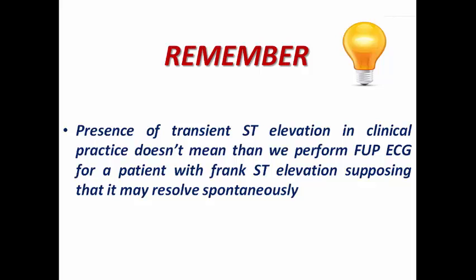So remember, presence of transient ST elevation in clinical practice doesn't mean that we perform follow-up ECG for a patient with frank ST elevation. I don't mean this, of course, because some people may suggest that in order to define STEMI, we should have persistent ST elevation in ECG, so you would have two serial ECGs. This is completely wrong, and just ST elevation in one ECG is enough to go for primary PCI.